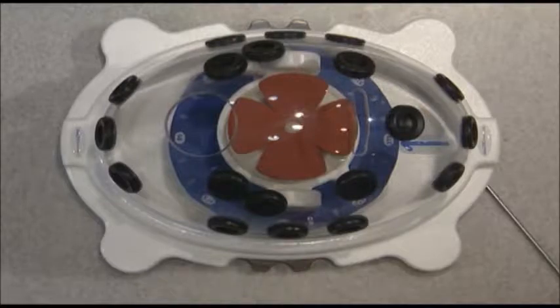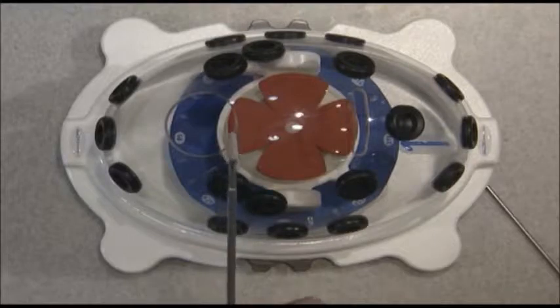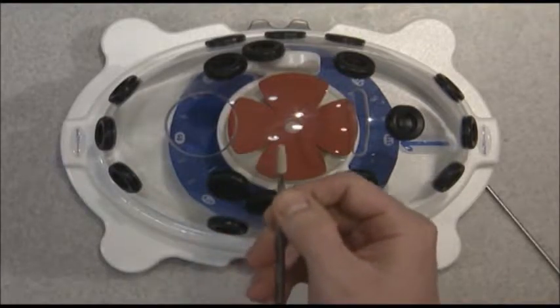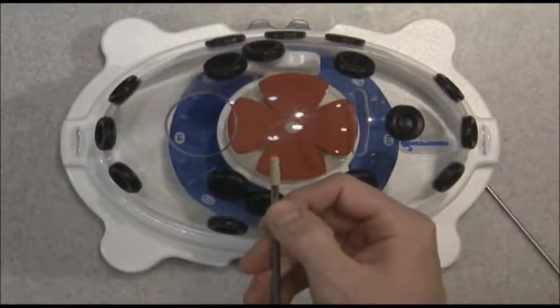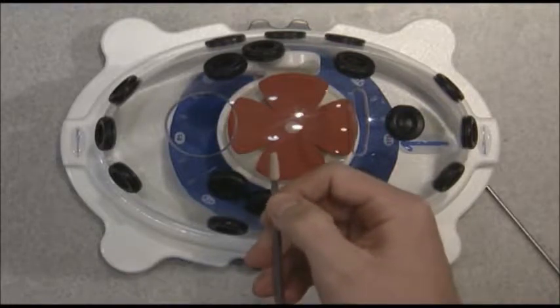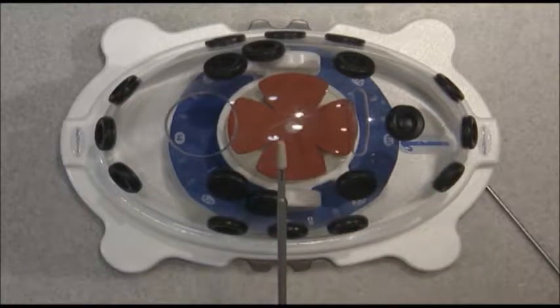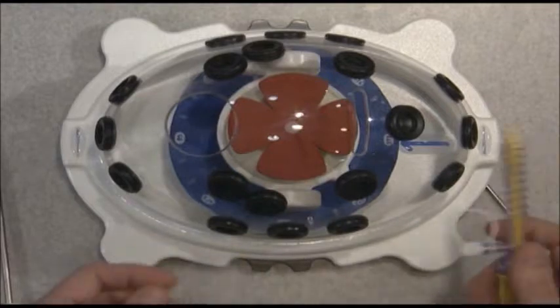I think before we do that, just a quick note on knowing your anchor that you're going to put in. Anchors can be made of various material. They can be plastic, biocomposite, or metal. Most anchors will have a little line, hopefully you can see that right there, that will reference how the threads or how the sutures are traveling within the anchor, either collinear with that line or directly perpendicular to it. And different anchors are different, so it's just important to know which so that you have optimal sliding of your sutures.